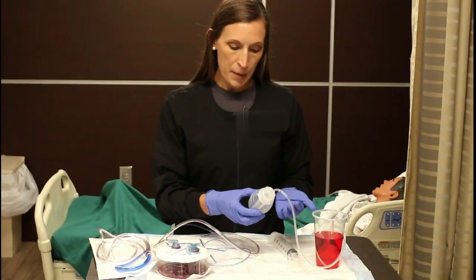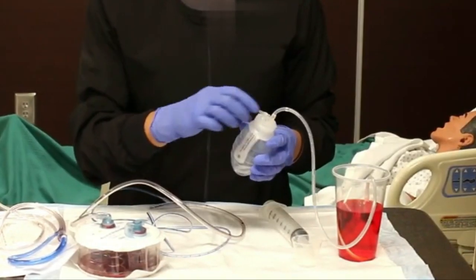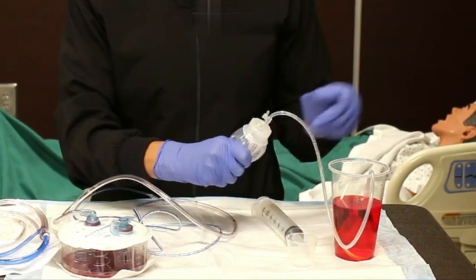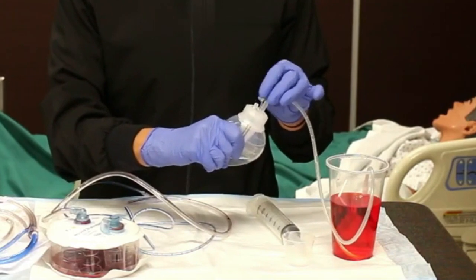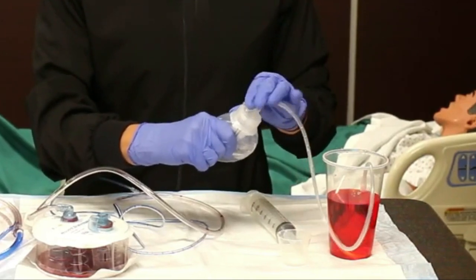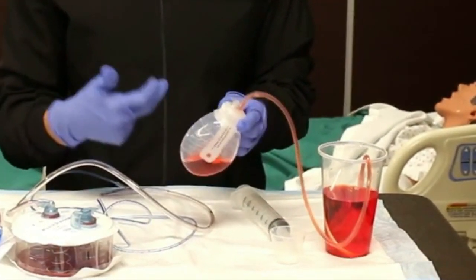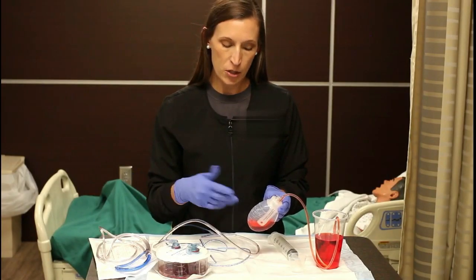To operate the JP drain, it's a negative pressure vacuum. To activate the vacuum, you open the little knob here and you squeeze it. I do have it in a cup so you can see how this works. Once you squeeze it, you're supposed to take your alcohol pad and wipe it off, then you replace the top. When you let go, it creates a negative pressure and then it pulls the fluid, blood, or whatever it's sucking up into the JP drain. It's also called a Jackson Pratt drain, but most people just say JP.